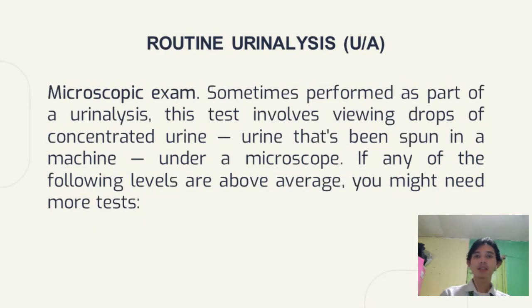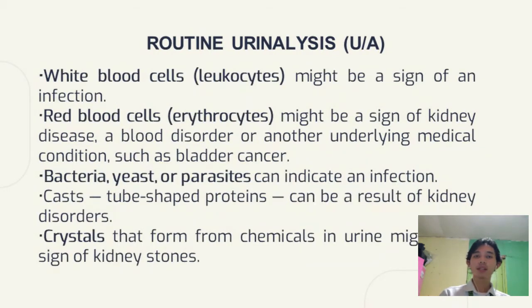So lastly is the microscopic exam, sometimes performed as part of a urinalysis. This test involves viewing drops of concentrated urine that's been spun in a machine under a microscope. If any of the following levels are above average, you might need more tests. White blood cells or leukocytes might be a sign of an infection.